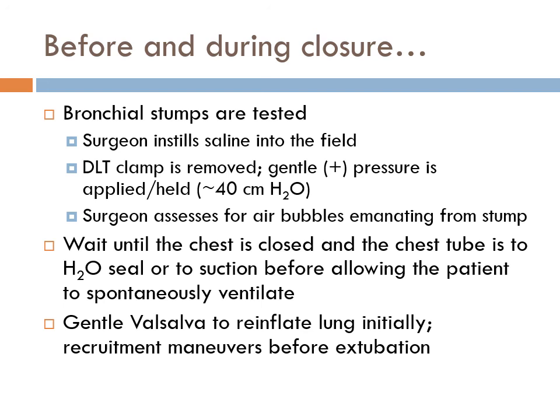They don't care what happens to patients afterwards. They're just operating. Oh, I'm going. Give me a second, I'm going. And then close your pop off and hold pressure. Hopefully you have a Mapleson circuit that has an actual pressure gauge on there. You can find ones that can also go in between, but you're going to hold pressure maybe at 40, whatever it is, and then it eliminates having to turn a ventilator off in order to do this. Because again, you can't just turn the ventilator to vital capacity and think you're going to just open the lungs up that fast. You have to slowly bring the lung back up before you can apply the pressure at 40 or 30, whatever you want.